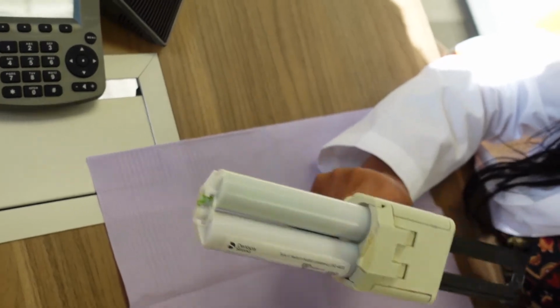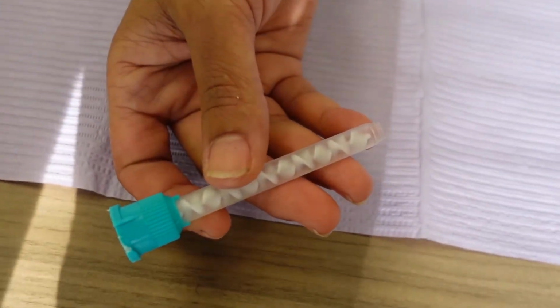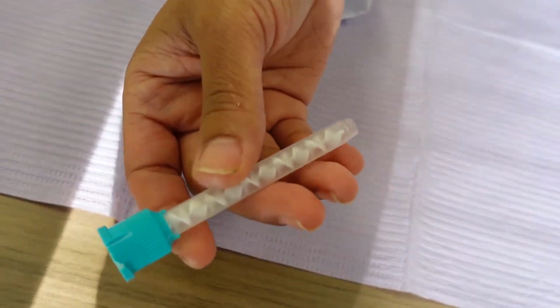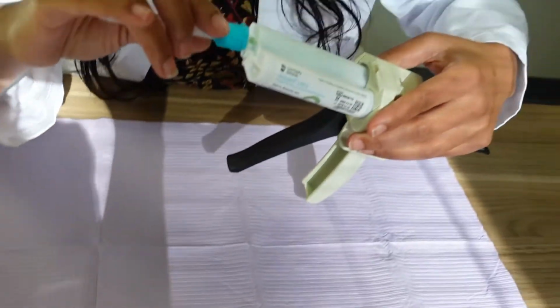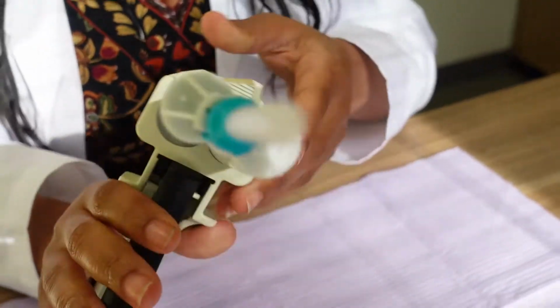All right, so let's place a tip on it. This is an actual tip. We call it a blue tip. It comes in a pack of 20, 30, 40. This is used to dispense the actual material. All right, so here we go.